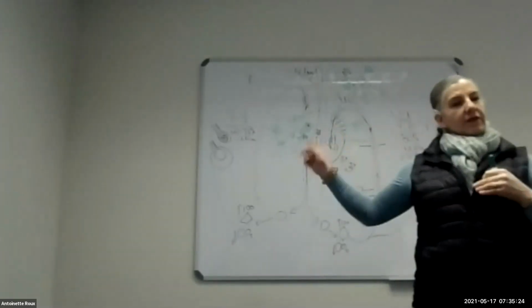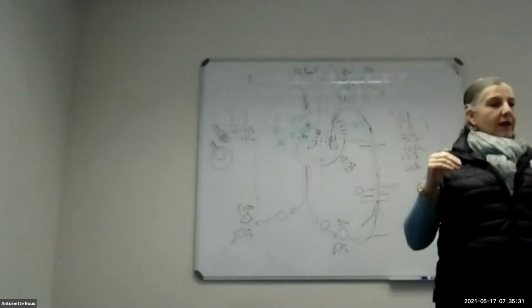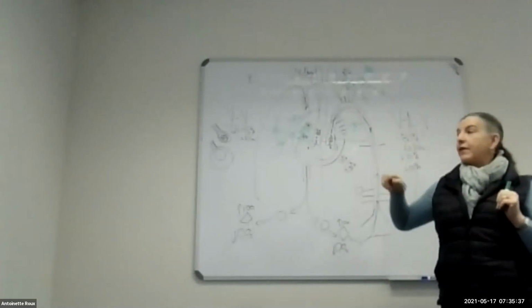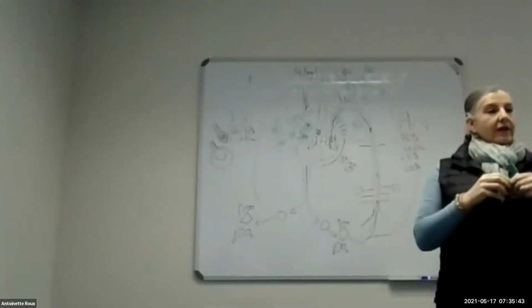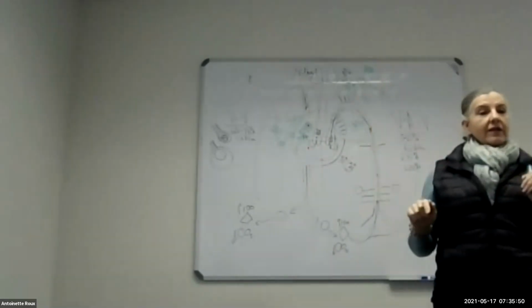Then if you're on VV ECMO and your patient becomes septic, then it means you've got a cardiac output problem now. Okay, so now your cardiac output is going to drop a little bit. Your SVO2s will drop. Then it actually means you need to change from VV ECMO to VA ECMO to accommodate that, because the heart's not contracting properly. So septic shock, cardiogenic shock, all those things will happen, and you need to opt for a different modality.